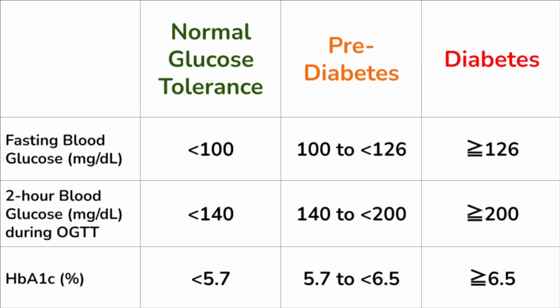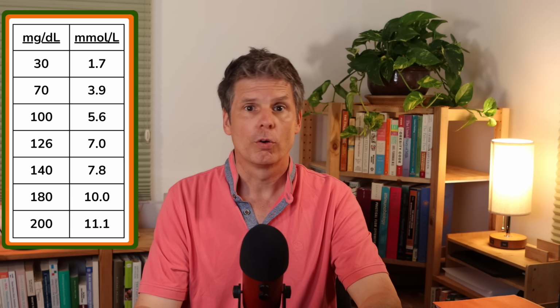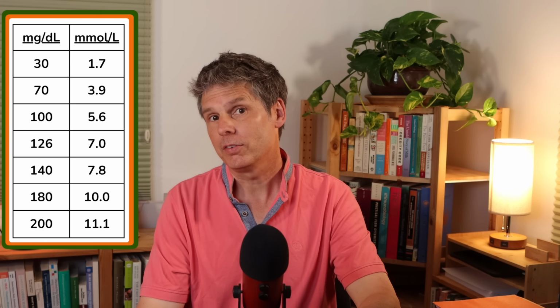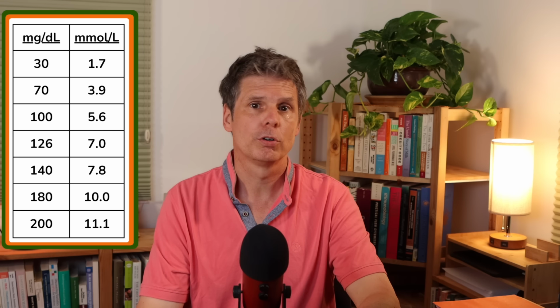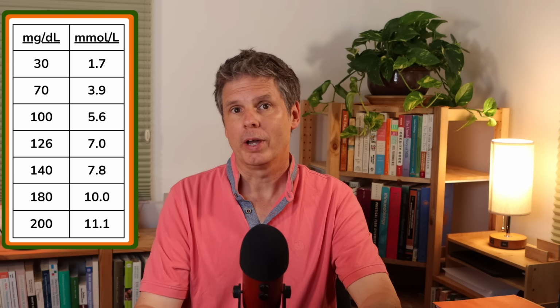Are these still elevated above your normal baseline level? As you can see in this table, elevated 2-hour glucose levels are a diagnostic criterion for prediabetes and diabetes. But that is in the context of a 75-gram oral glucose tolerance test. This test involves drinking a beverage containing 75 grams of pure glucose, and this much glucose by itself, without any other food, is a much more substantial load to handle than an average meal, even a high-carb meal.